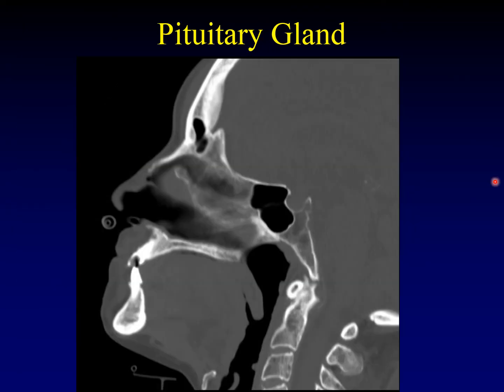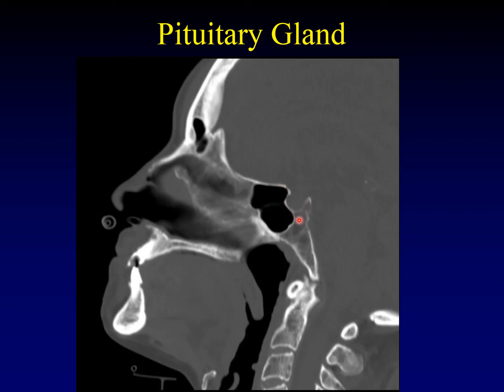The pituitary gland has a predictable location at the top of the clivus. On this midline sagittal image, the triangular bone is the clivus, and here is the sphenoid sinus. The sphenoid sinus pneumatizes to a variable degree. Sometimes it sits anteriorly, barely touching the sella turcica. Sometimes, like in this example, it wraps about halfway around the sella. Sometimes you get a very well-pneumatized sphenoid sinus that wraps all the way up into the dorsum sella and completely surrounds the pituitary gland. All of these are normal relationships between the sella turcica and the sphenoid sinus.